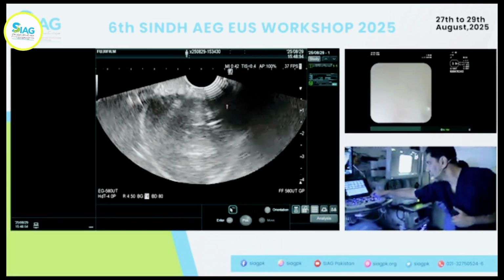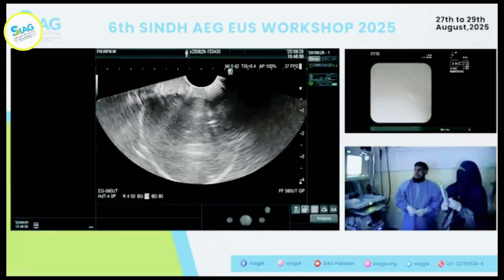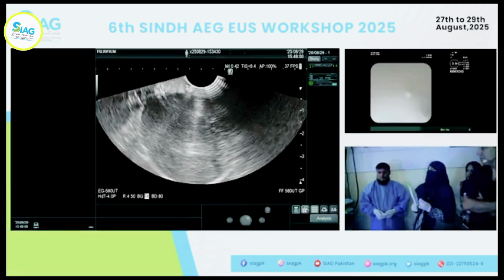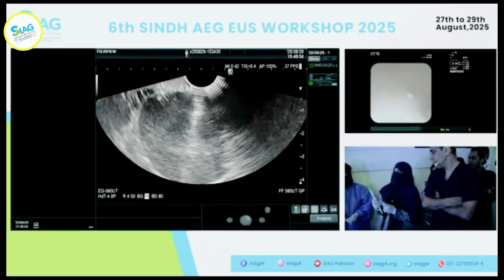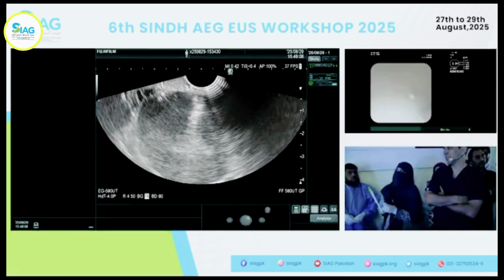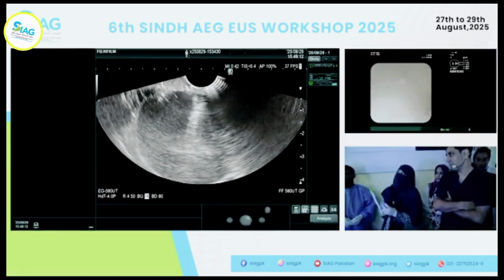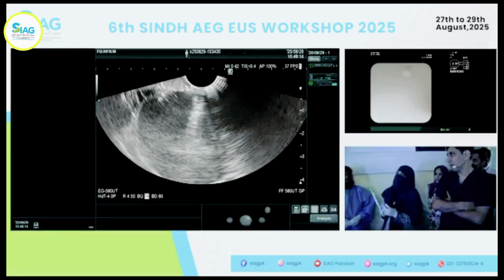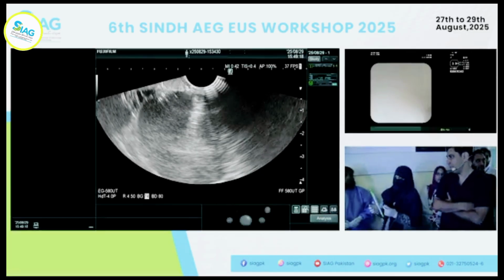आप थोड़ा सा अपना लेंस क्लीन करें तो आपको वो भी नजर आ जाएगी, दोनों साइड नजर आएगी, राइट? हाँ, तो देखें उसमें नजर आ रही है तो you can use that. We'll work on this a little bit more. I think that is because there is air. Okay, so when the thing, it's very thin, so you're not able to appreciate it. The model that we are making next will hopefully not have this problem.